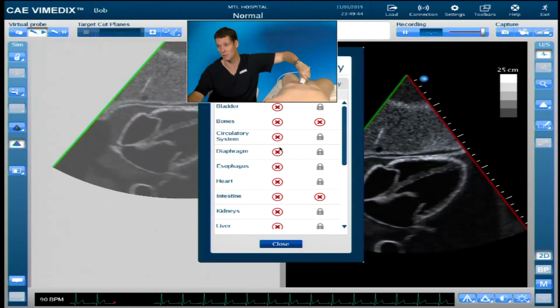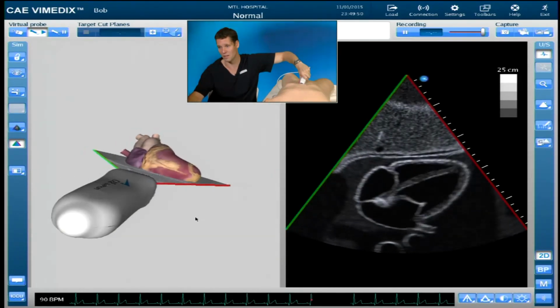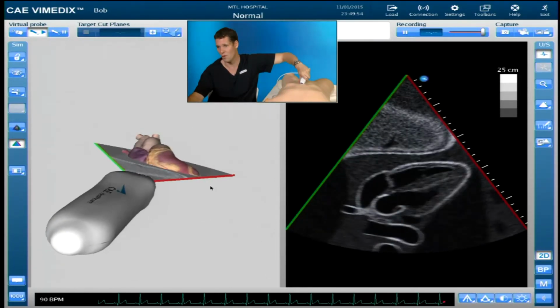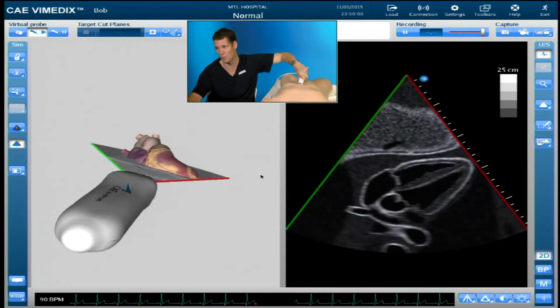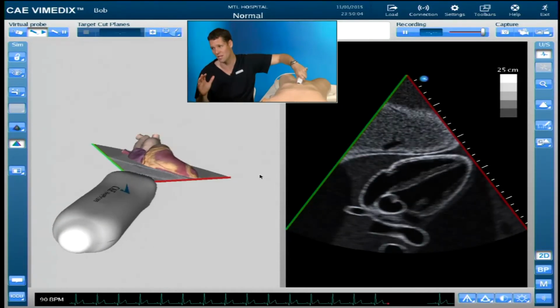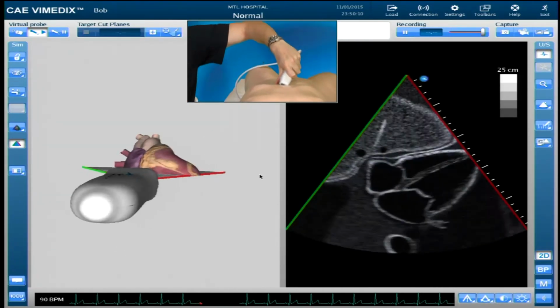If you see the aortic valve coming in, we know that we have imaged too far anteriorly. So we've got to fan backwards, point more posteriorly. And again, we do one movement at a time. If you see the aortic valve, we move back a little bit, and then we can start to do little bits of rotation, trying to make that ventricle look as big as possible.